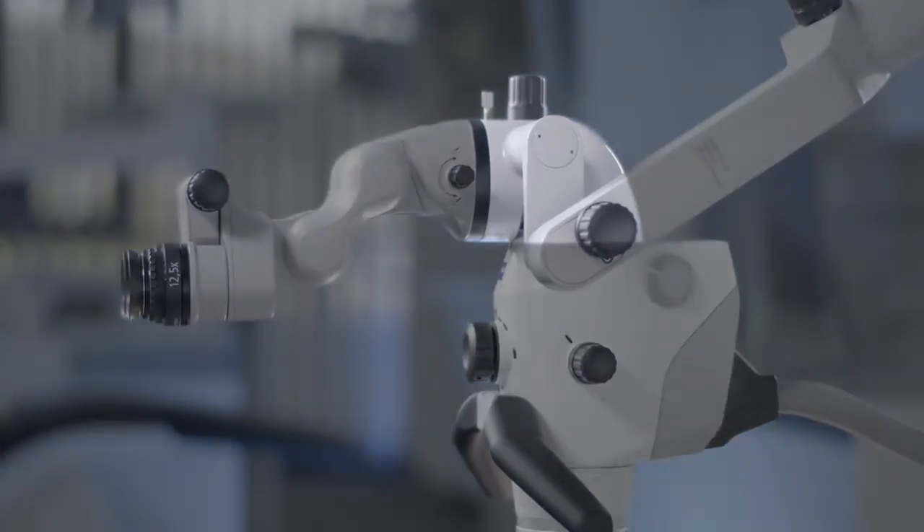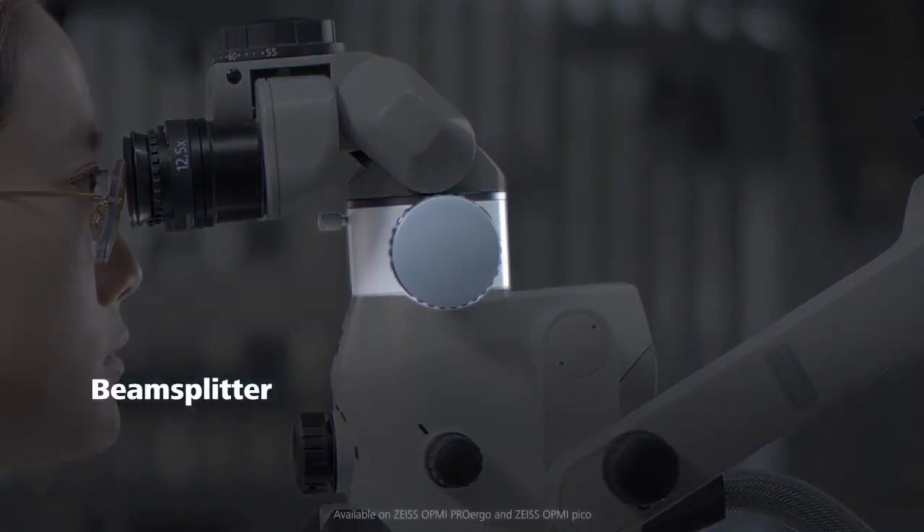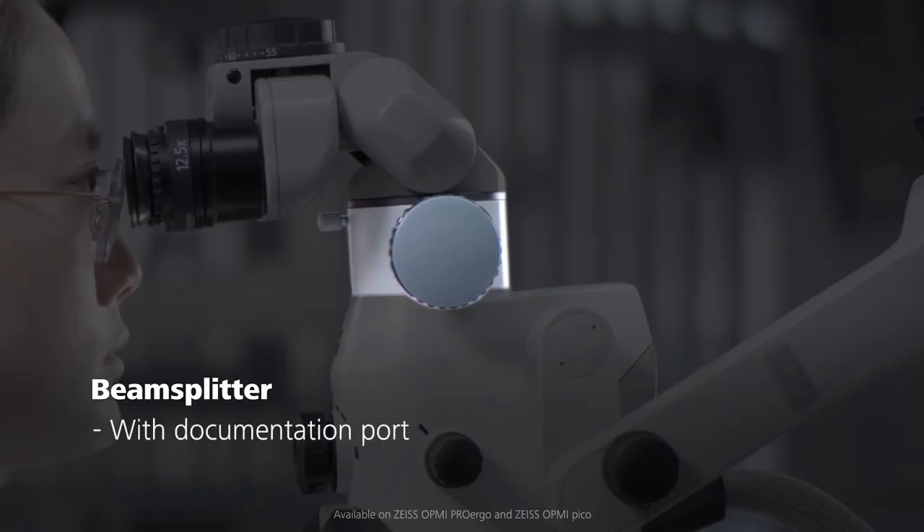The extender is placed between the microscope body and the binocular tube. The beam splitter provides a documentation port and can be used to attach an external camera to the microscope. Additionally, it adds length in the height.